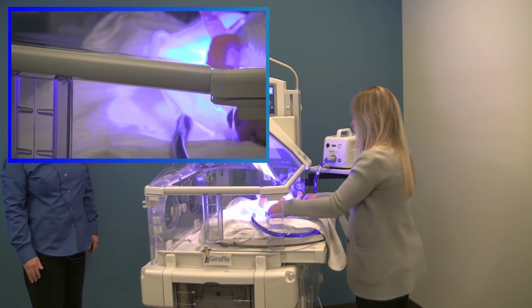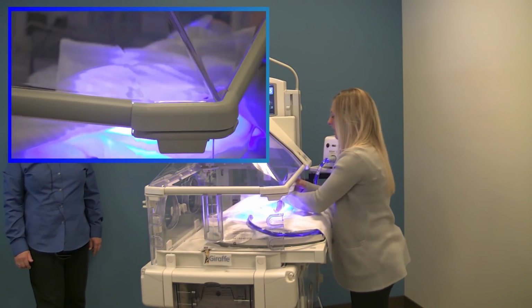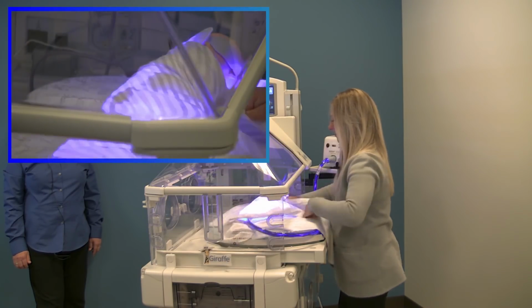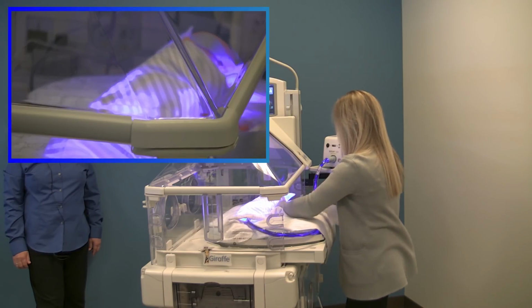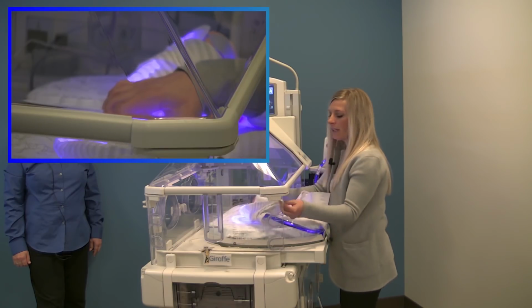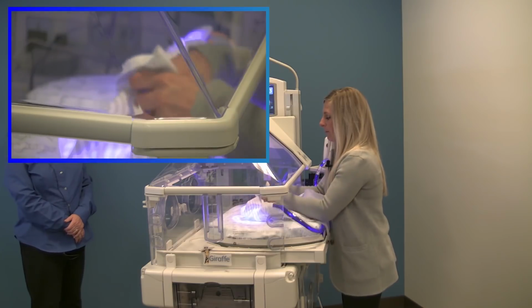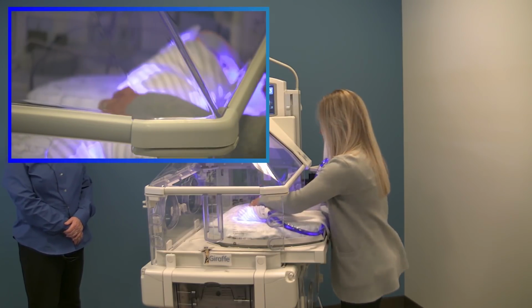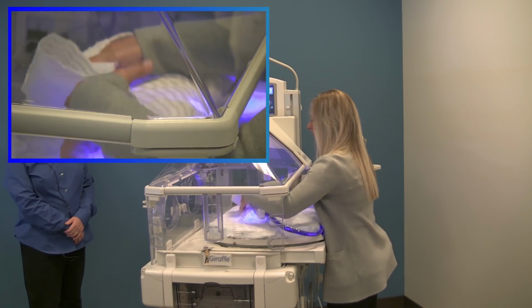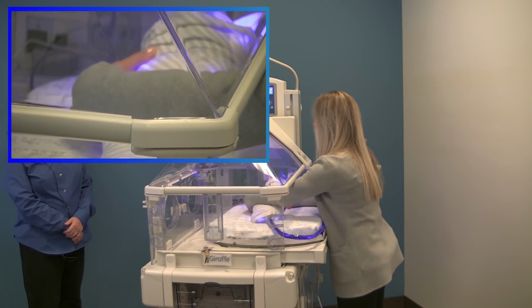All right, so we've got the baby on the BiliSoft 2.0 pad. We can just bring hands to mouth. Again, the swaddle may not be my tightest swaddle ever because I'm coming from the other side. Now you can leave that bottom tip either undone and just dangling for that cable, or you can tuck it in. Either way, whatever works for you. And so we just swaddle that baby like this.